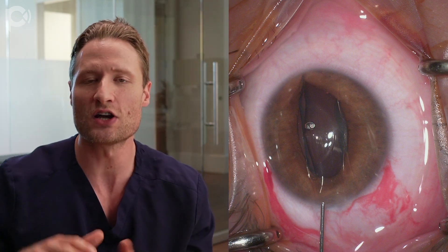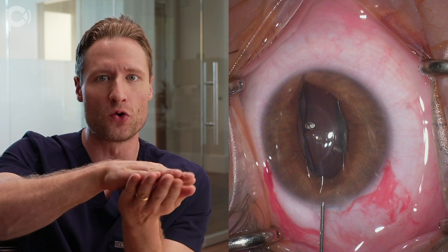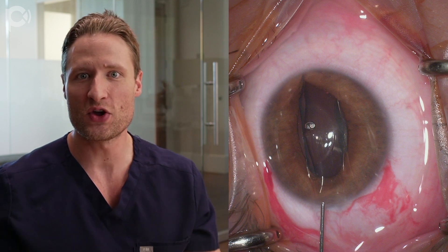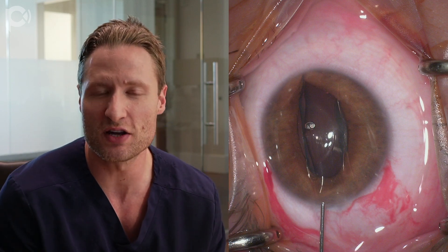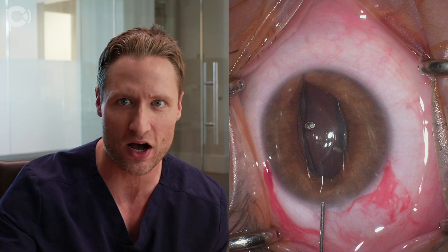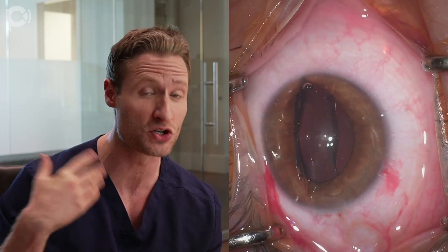You want to deepen the anterior chamber and have the lens unfold in the proper direction. The lens is folded with the hinge on the left — if the top flips over, the lens will be upside down, so you want the bottom of the lens to push out to unfold it from the taco position. I put a small volume of cohesive viscoelastic to give me a little working space without over-pressurizing this eye, which is already predisposed to floppy iris.